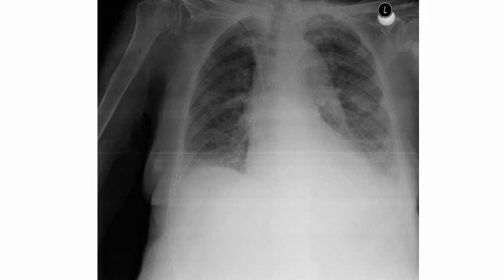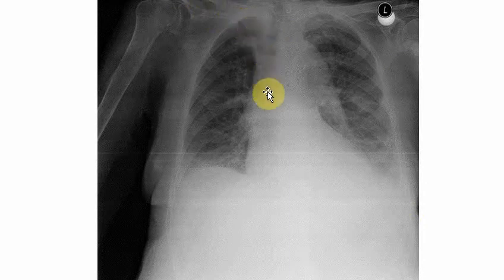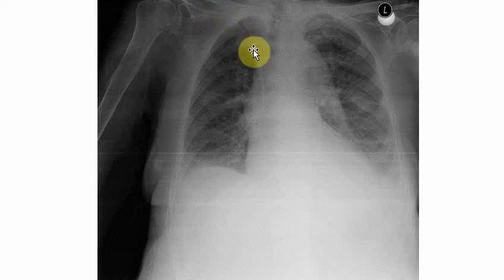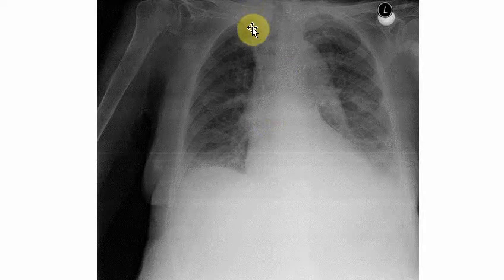This is also something interesting. Sometimes x-rays are used to check something — in this case there is a central venous catheter inserted, and the tip of the catheter should be at the base of the superior vena cava. In this case we can see that is true, and the x-ray was used to confirm that the placement was correct.